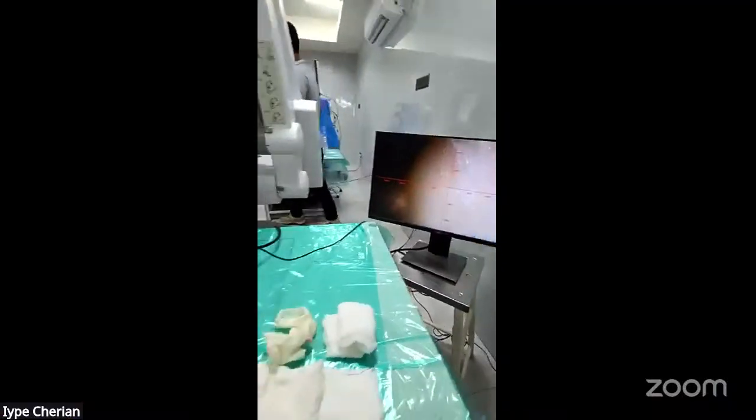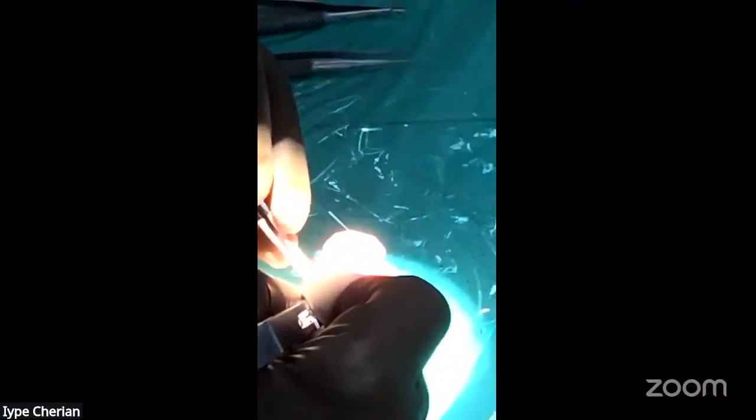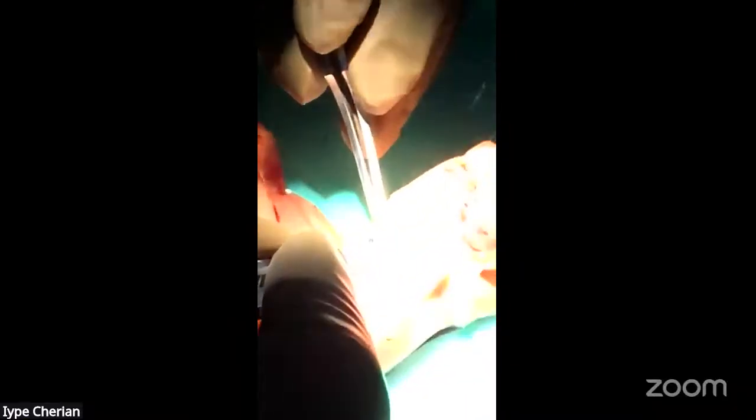Not the TV, just the field. Focus on it because it's too bright. You could go over a cadaver's brain with that camera, over the field, correct? Can you see that? Okay, so you can go over a cadaver skull, like an overhead camera, right?